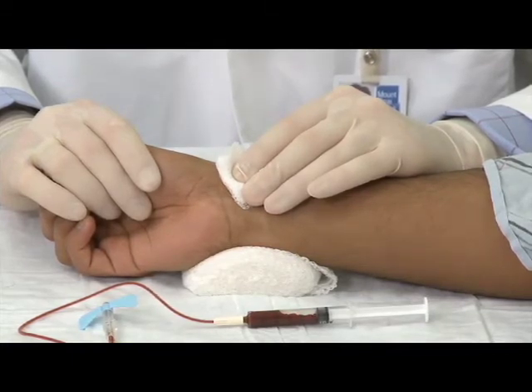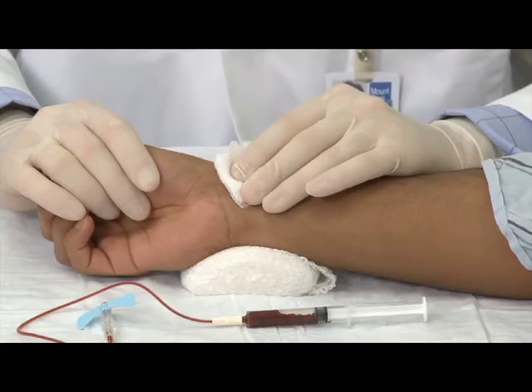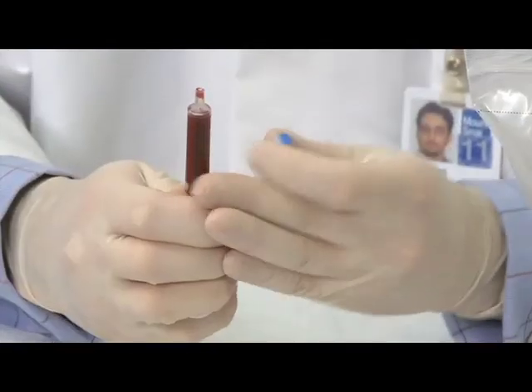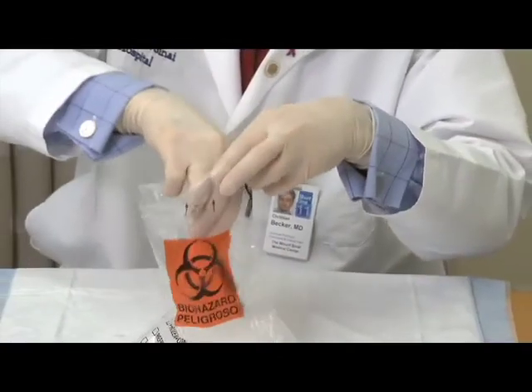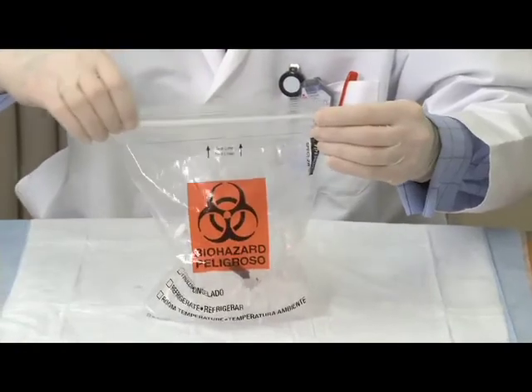Compress the site with sterile gauze immediately after needle removal for an appropriate duration to avoid hematoma formation. Press firmly to not only overcome venous but arterial pressure. Remove air bubbles from the sample. Place the sample on ice and analyze in a timely fashion.